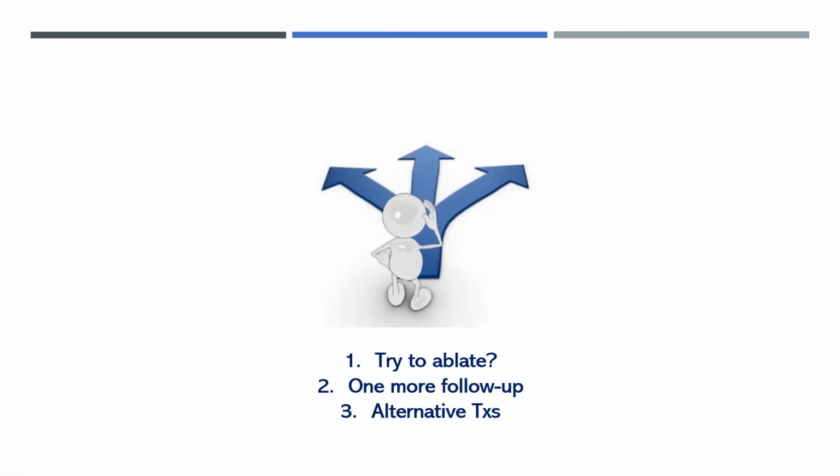For those inconspicuous tumors, at planning phase, we have three potential options. First, try to ablate with all assistant techniques, including fusion, contrast-enhanced ultrasound, and artificial ascites. Second, close follow-up until the conspicuity clearly increased to guarantee accurate and optimal ablation.